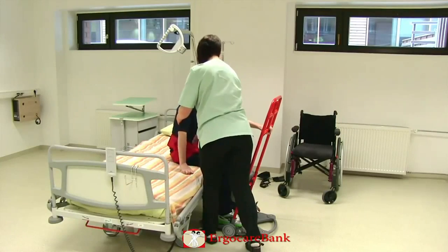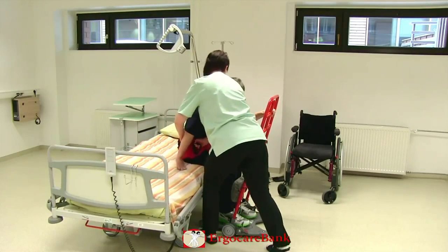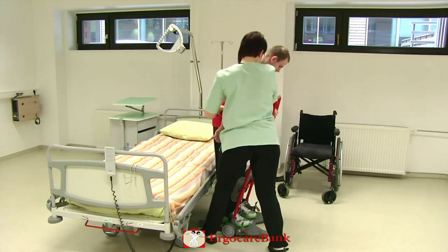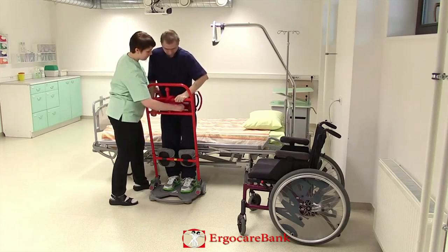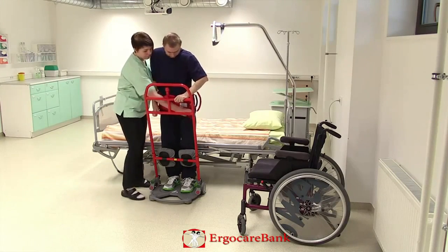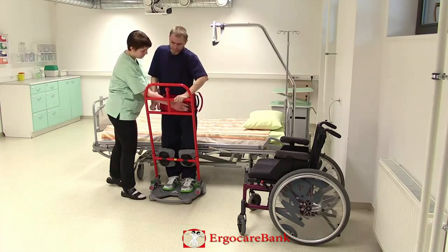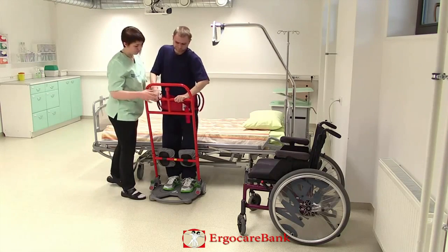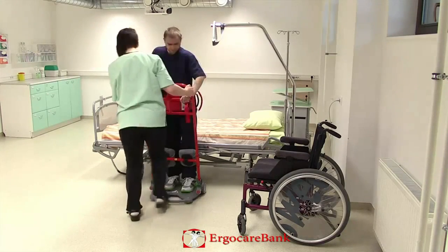In assisting Charlie to stand up, she puts both hands on the belt at Charlie's weaker side and shifts her body weight backwards as Charlie stands up. She fastens the strap to the return and helps position Charlie's hand, releases the brake, and drives him right up to the wheelchair.